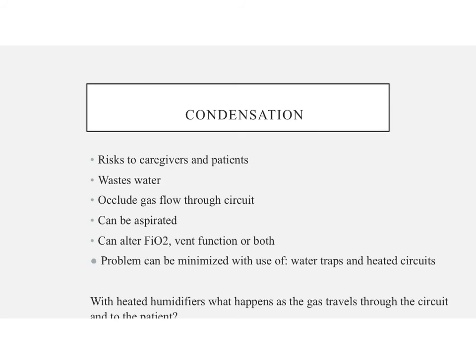So we are going to go over the heated humidifiers now. One of the biggest problems with heated humidity is condensation. It poses a risk to caregivers and patients, and that is of infection. Anytime that you have condensation or aerosol particles and you risk bacteria colonizing, you are risking an infection to the patients. But if you have to break the circuit and change the circuit, or you're breaking the circuit to put in a nebulizer in line, then you risk posing a threat of infection to yourself as well.